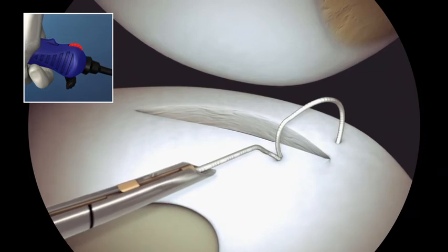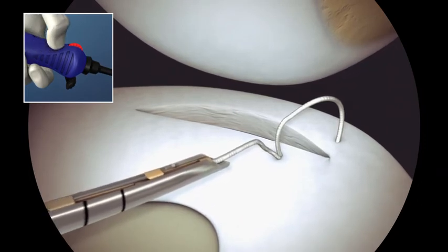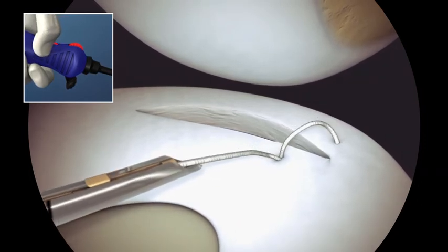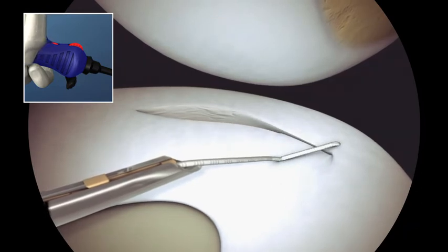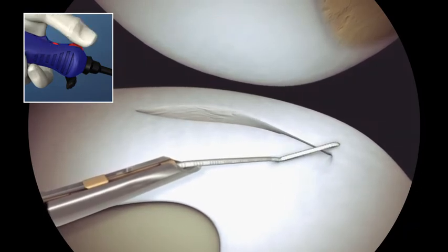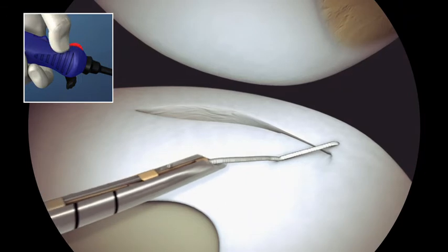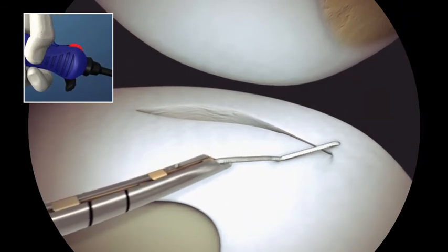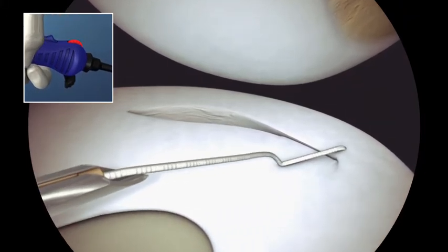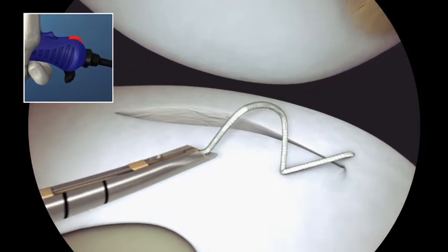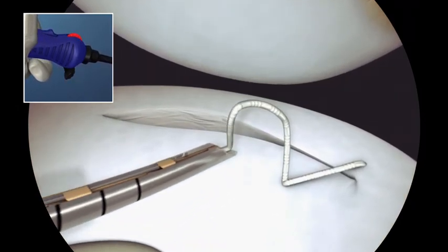Withdraw the needle from the meniscus. Move the switch into the ratchet position. Pull back to tighten the stitch and reel the suture in to remove excess slack. Move the switch into the freewheel position. Repeat the steps to create multiple sequential stitches.